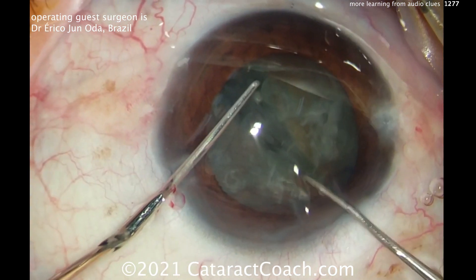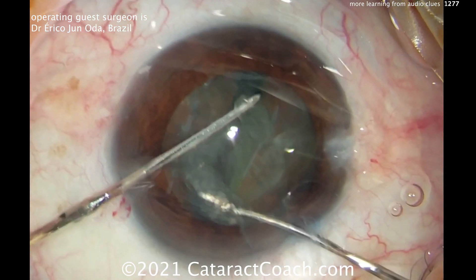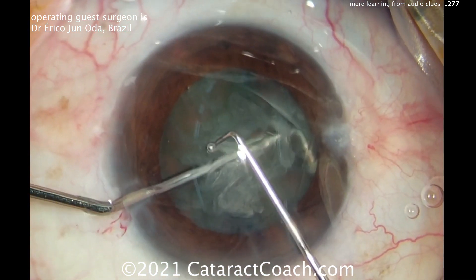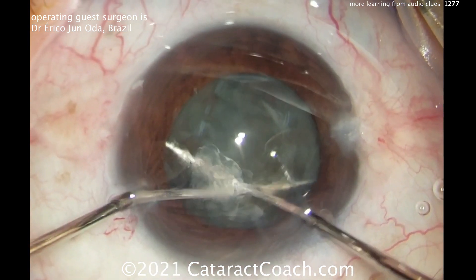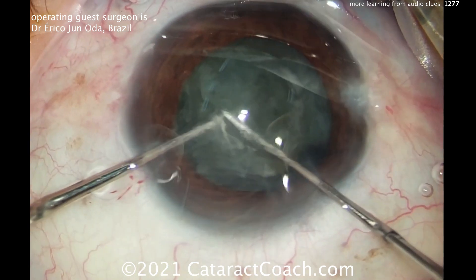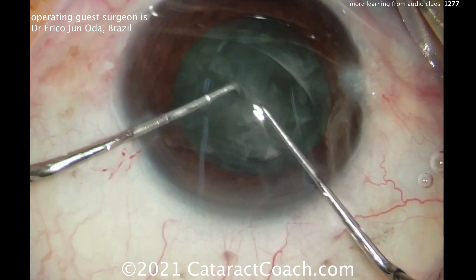You hear his music in the background. If you understand Portuguese, you can enjoy it — I have no concept. So now he's going to split the nucleus again, and then what I want to really show you is the sound of the FACO machines.